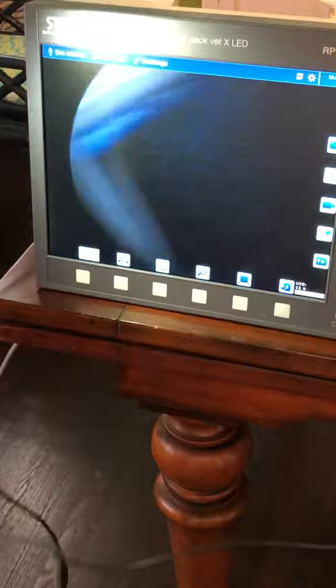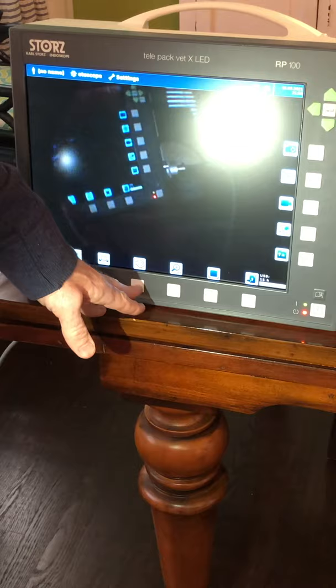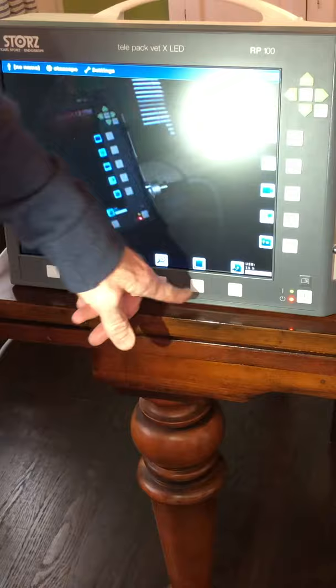The next button is your air pump, which is for GI endoscopy and sometimes trans-cervical insemination cases, but for most rigid scope cases you won't use it. This is a zoom — it's a digital zoom, two times, which doubles the size of the image. This next button gets rid of your icons, so if they're bothering you, you can turn those off.